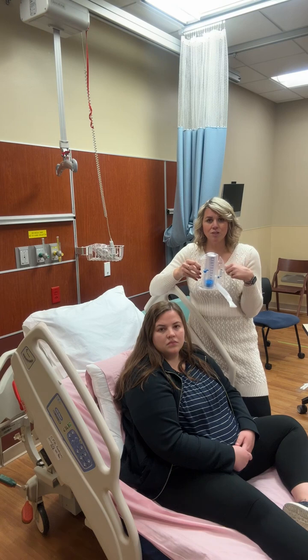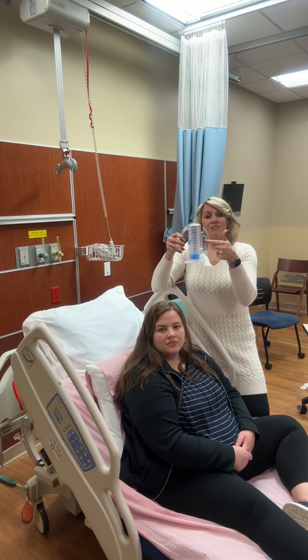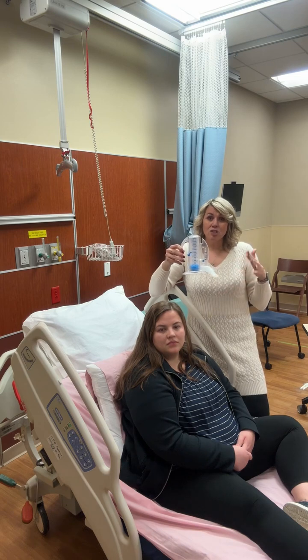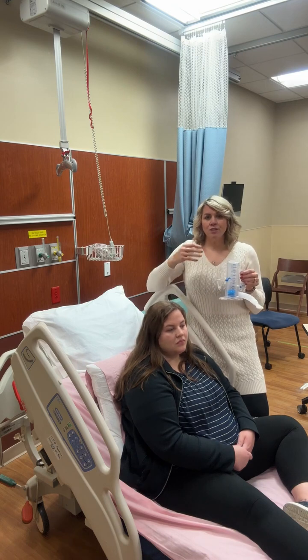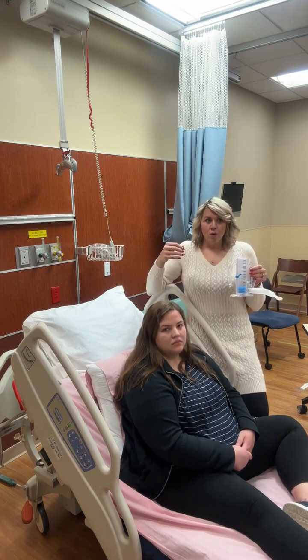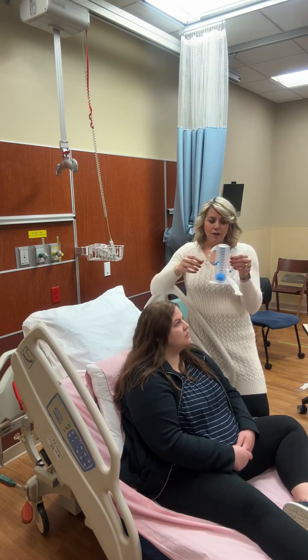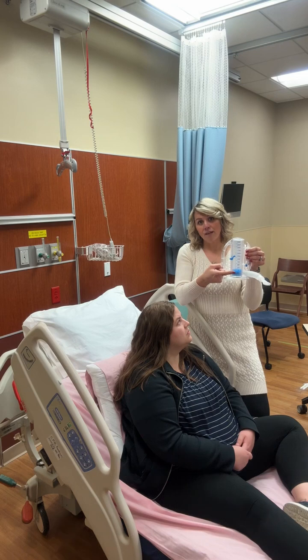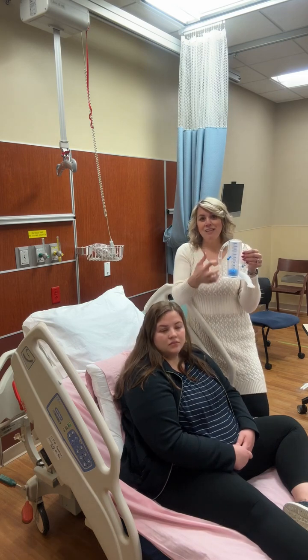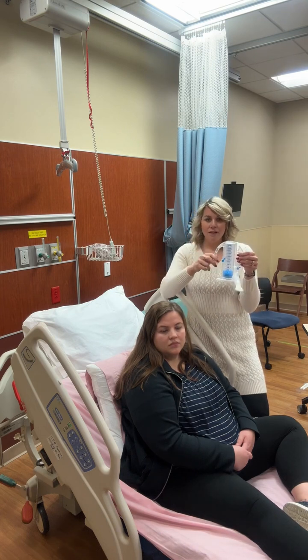That wasn't cool. So we want to tell them right away from the get-go, this indicator needs to kind of levitate right here in the middle. We want it to hang out right in the middle. And the way to do that is to take a slow, deep breath, and you want to control your breathing, right? So when you're doing that, you're doing one of these. And that's how you want to show them how to do it and then have them do it, all right? When they breathe in, this is going to move up if they breathe in correctly. The idea is to inhale. You're sucking on this mouthpiece to get this to come up, okay? That's the idea of this device.